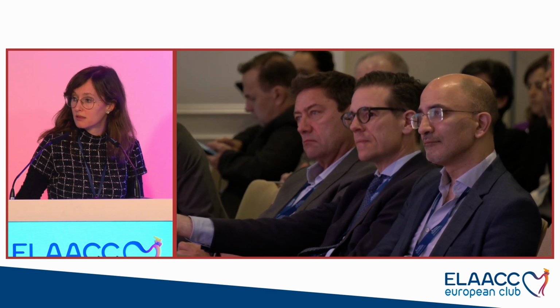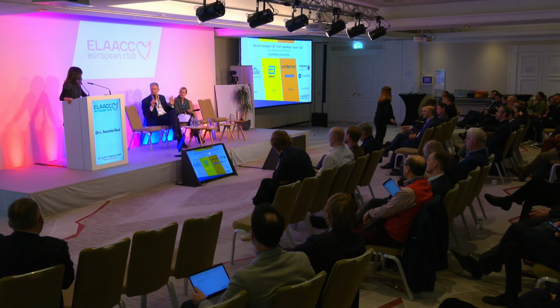The image is amazing, but the question of Nina, in this room where we have the most expert in Europe, only 2 centers are using this technology. What is your interpretation? Because it's too complex for the operators? What is a possible explanation why we are not using this approach in the main of the centers?